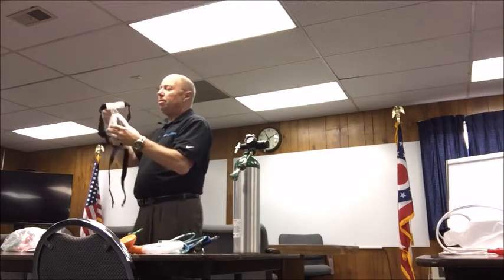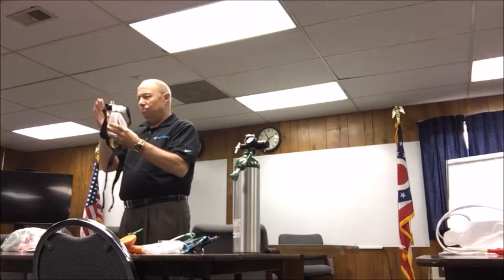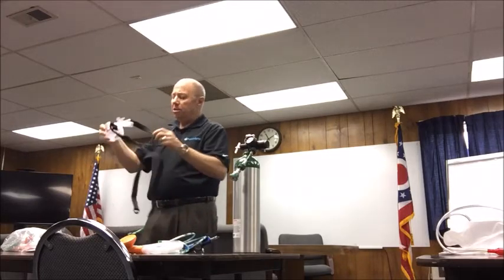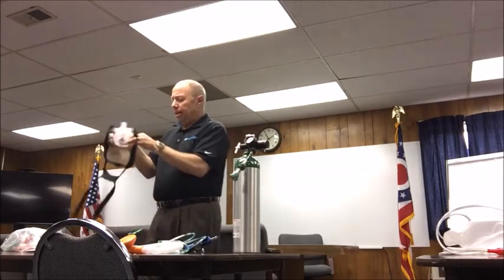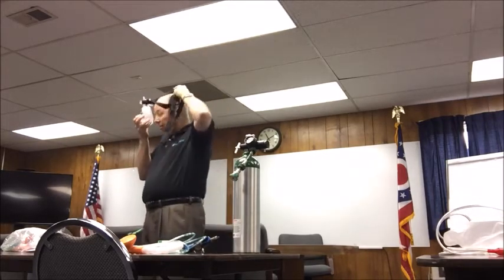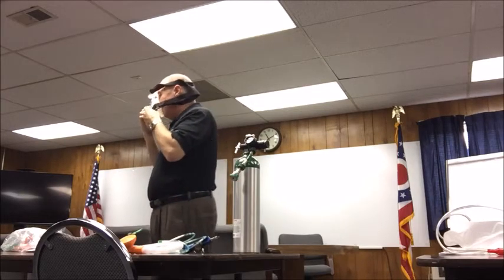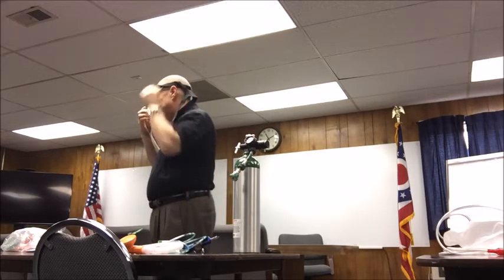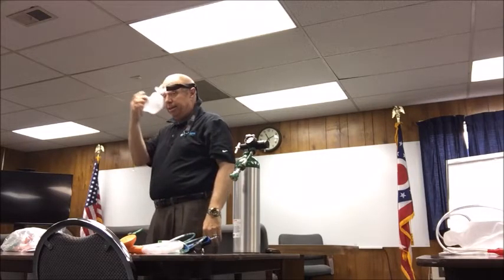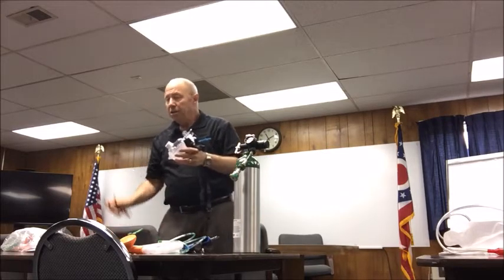The head straps or the head pad adjust up or down, in or out for patient comfort. There's no set place where to put that. One of the other advantages to this mask is once I get it on the patient, the bottoms clip in. If I want to give a nitro, all I have to do is unclip the bottom straps, and this swings up 90 degrees to give a nitro, and I can put it right back on without taking it off. I'm sorry, I'm talking through the mask. So that's another advantage.